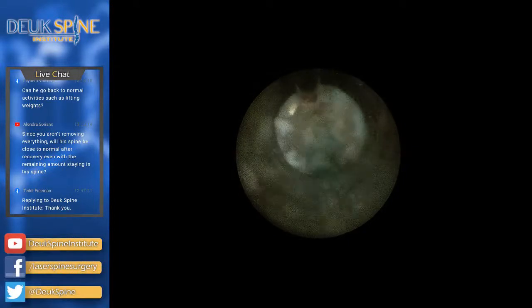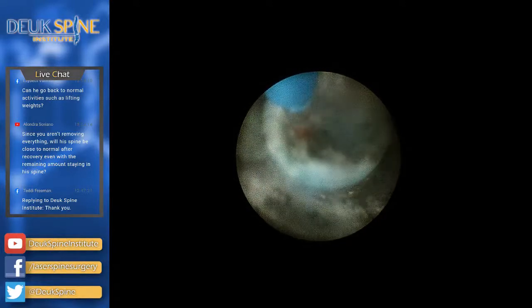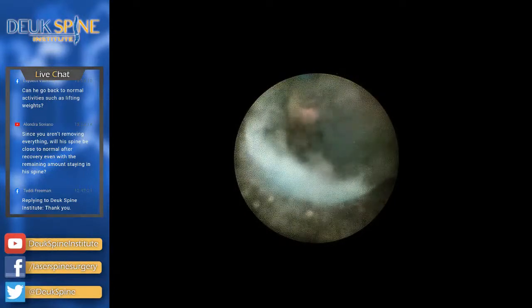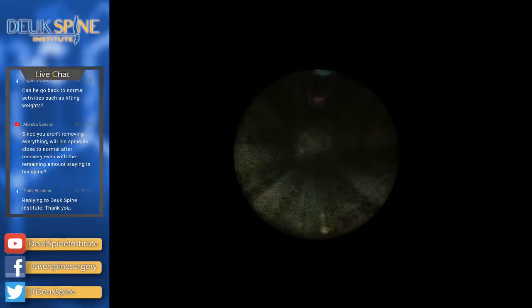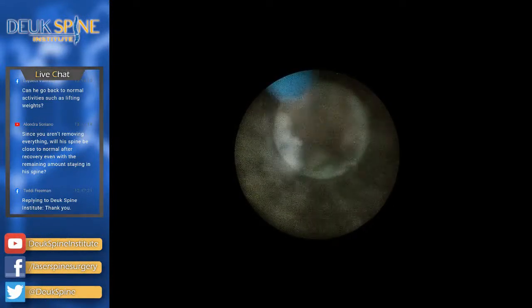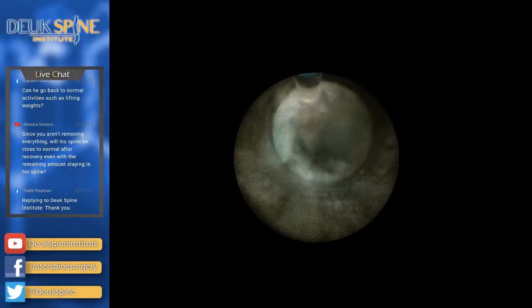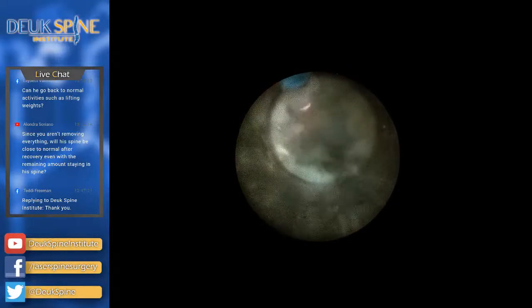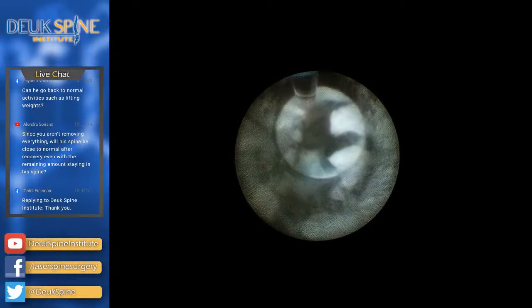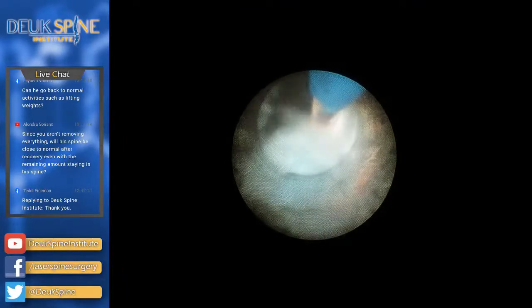We have another question. Sure. We have a viewer asking, after the surgery, can the patient go back to normal activities such as lifting weights? So, great question. The answer is yes, but not right after surgery. This patient and every patient that has the laser surgery needs time to heal. They have to heal. I cannot heal the patient. Remember I said that earlier, okay? I can remove the herniation, I can clean the annular tear, but I cannot heal the patient.